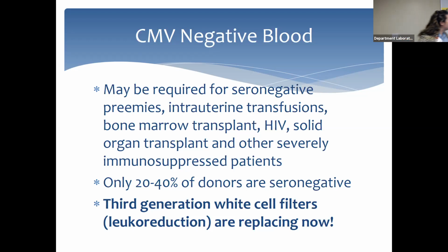And I put this in there. Remember, leukoreduction is really replacing the need for CMV negative, right? So don't be surprised. When you enter your internship to start working in a blood bank, they no longer worry about CMV. All of their products are leukoreduced, okay?